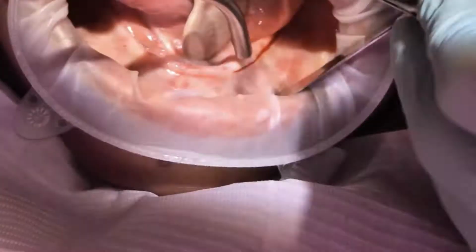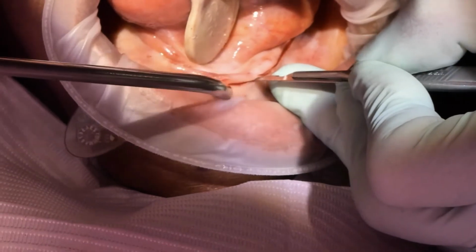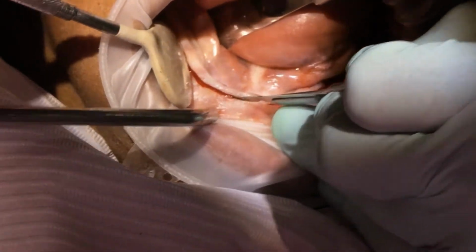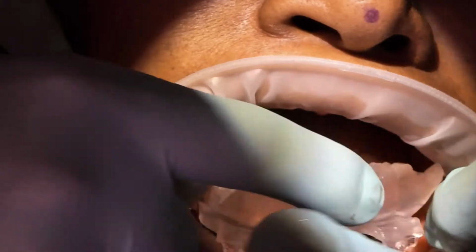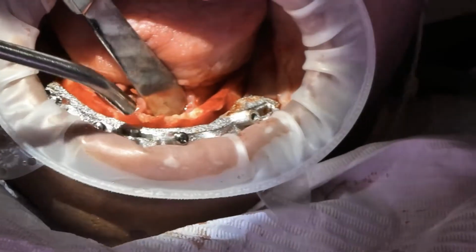Okay, now on to the mandibular. The mandibular pin guide fits against the maxillary pin guide, but it also fits against the new maxillary prosthetic. This way we can ensure that there's a perfect seating of the pin guide. If you'll recall, the labial sites were already drilled at the very beginning of the procedure. So at this point, Dr. Towell is just going to lay the flap and then reinsert the pin guide in order to seat the fixation base. The fixation base may also be able to be seated by simply laying the labial flap and then finding the holes to pin into place.